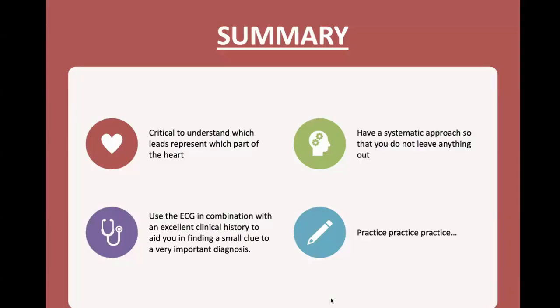Before I summarize my take-home points, I'd like to emphasize that there is not one single best way to interpret a 12-lead ECG. However, it is important that we as clinicians adopt an approach that is systematic and methodical to ensure that important abnormalities are not being missed.